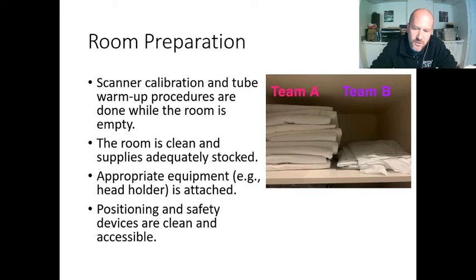Make sure that the equipment's prepped and ready to go for the patient. Everything's ready, like in terms of emesis bags and washcloths and anything, suction canisters, IV supplies. It can get freaky pretty quick.